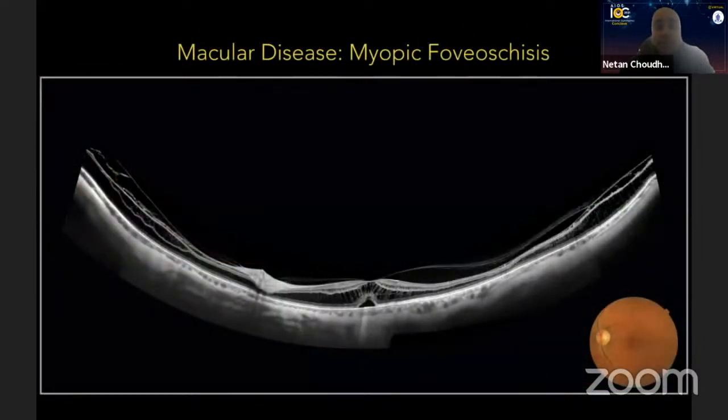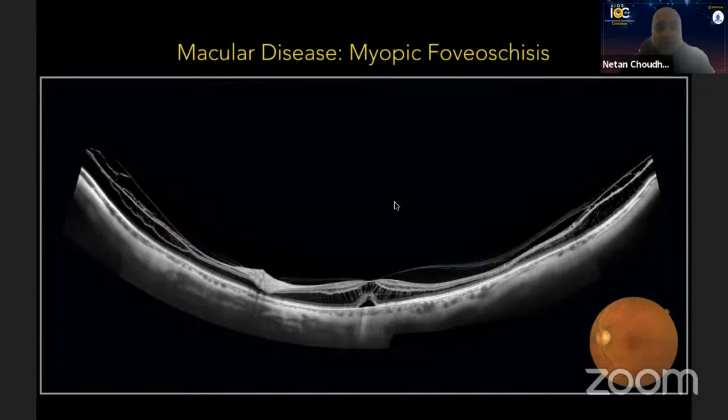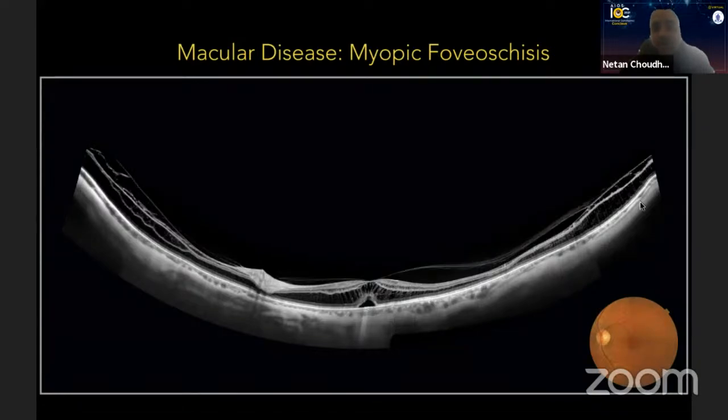The macula is not without sacrifice here. You know, myopic foveoschisis, and Carl in another video showed earlier. These are very challenging cases. Being able to preoperatively identify and look at the vitreous in its entirety, which is really what's critical in this case, looking at the degree of schisis that's present just outside the macula as we edge out to the periphery is important, hopefully in the attempt of avoiding any intraoperative breaks.